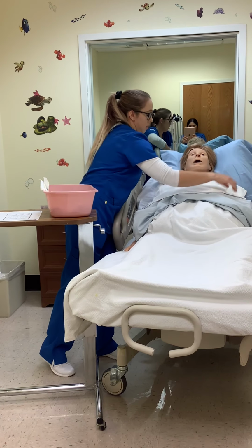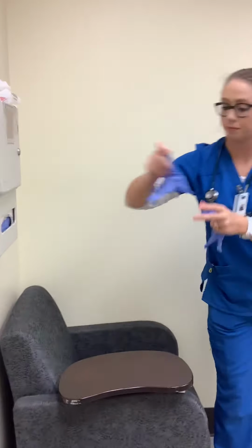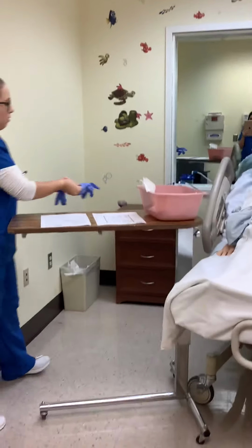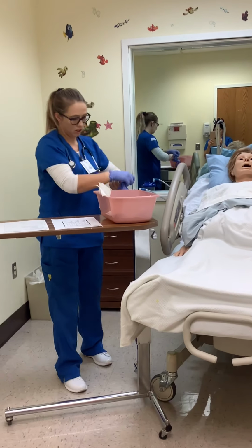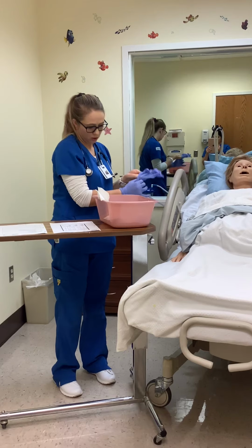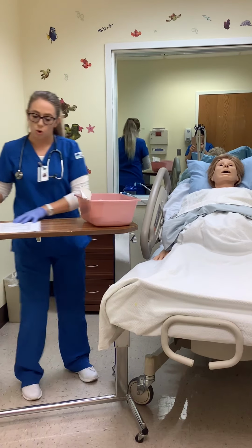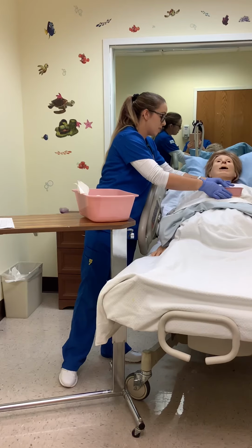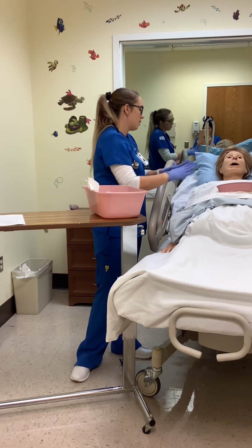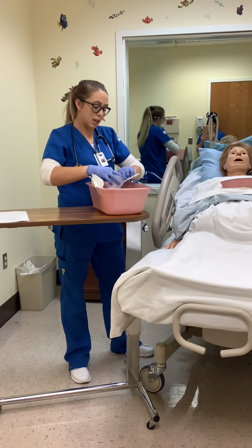Perfect. Now after that, I will don gloves. So just a couple of things here, Shirley. I'm going to have you hold on to this kidney basin here. This is just in case you experience some gag reflex. It's just a precaution. It is a little uncomfortable, but it'll only take a minute.